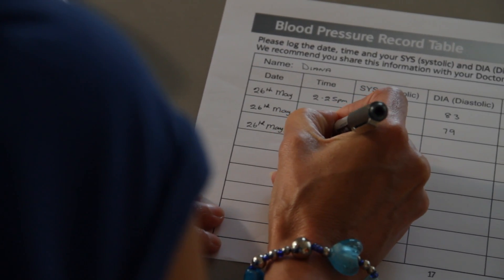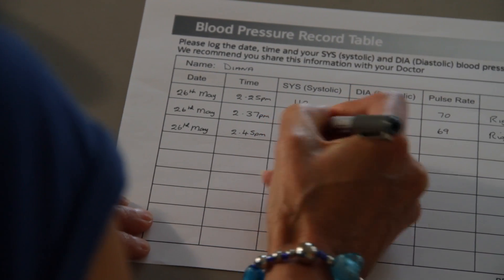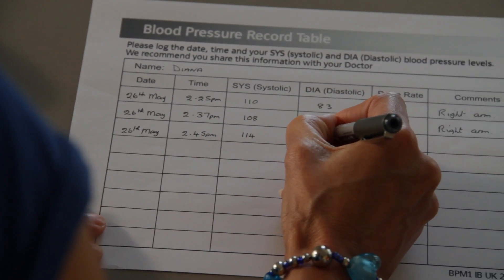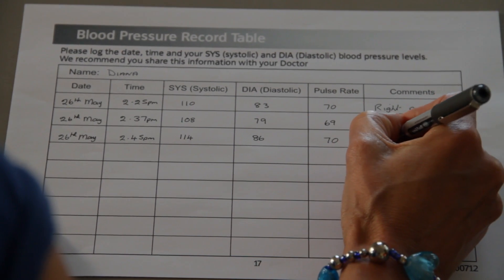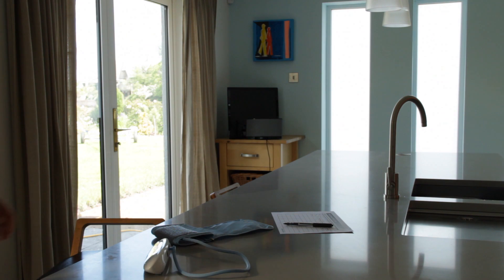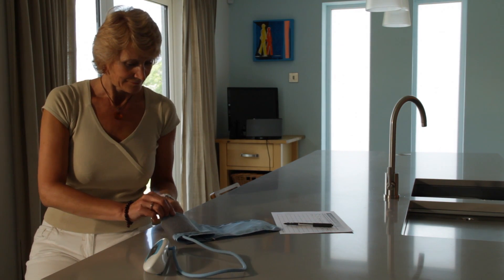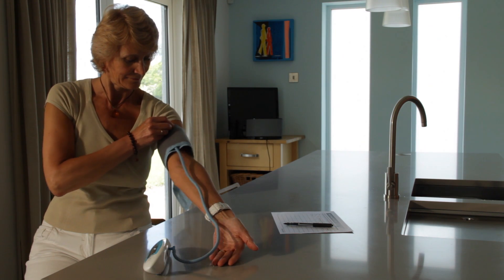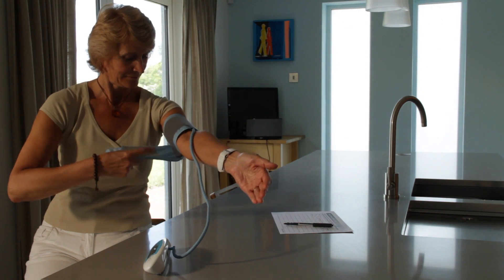For home measurements, the recommendation is that sets of two or three measurements should be taken twice a day — in the morning before taking blood pressure treatment, and again in the evening, approximately 12 hours later. Repeating this process over several days is ideal. Try to run the test consistently in the same room at the same times of day, ensuring you are fully rested at the time of each test.